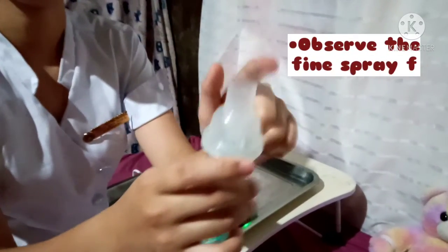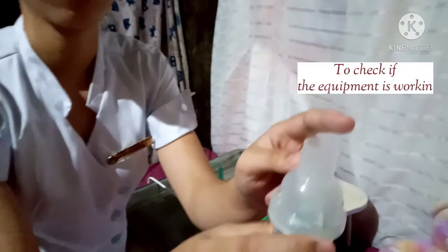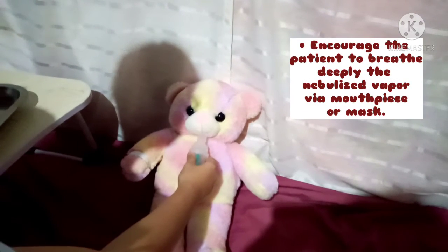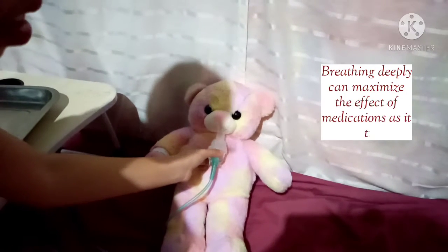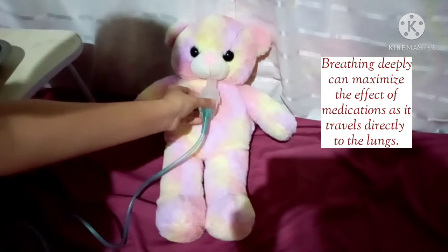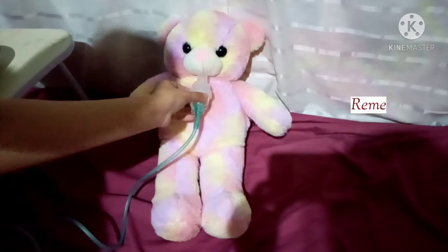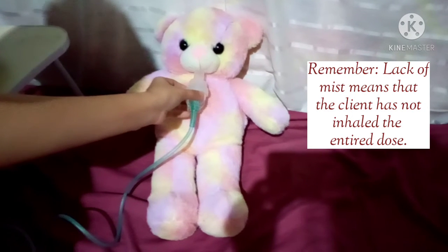Observe the fine spray from the nebulizer. This is a good way to check if the equipment is really working. Encourage the patient to breathe deeply the nebulized vapor via mouthpiece or mask. Breathing deeply can maximize the effect of medications as it travels directly to the lungs. Remain with the patient until all the solution has been nebulized. Remember that lack of mist means that the client has not inhaled the entire dose.